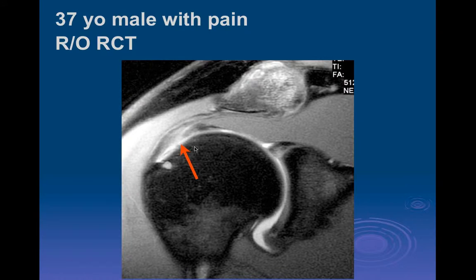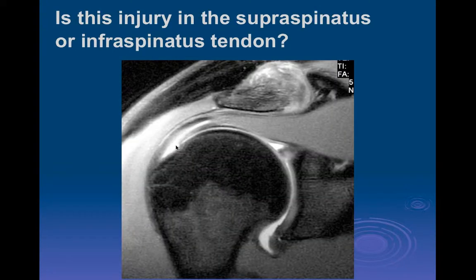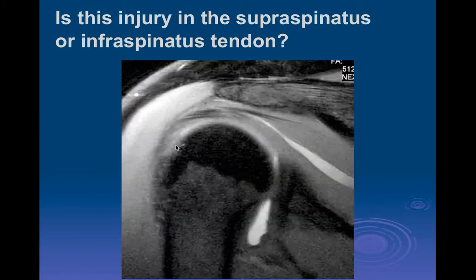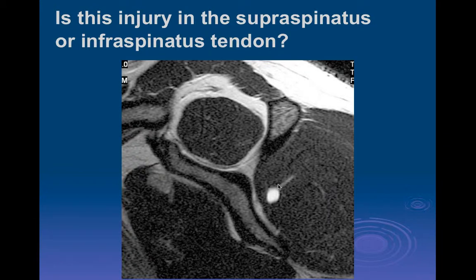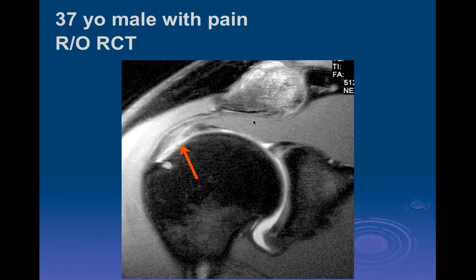Here's a 37-year-old male evaluated for rule-out rotator cuff tear. We can see a tear extending to the inferior articular surface, and if you follow it farther out, it extends primarily into the infraspinatus. Even though this looks like it's in the supraspinatus tendon, you have to realize that the posterior third of the fibers of the supraspinatus and the anterior half to a third of the infraspinatus fibers co-mingle when they insert on the greater tuberosity—they really overlap in that location.